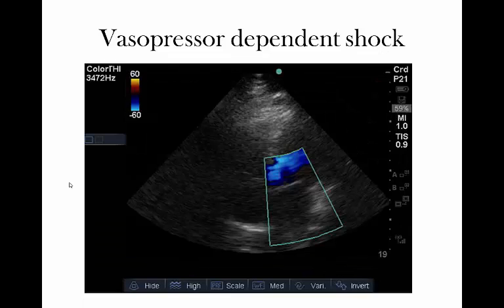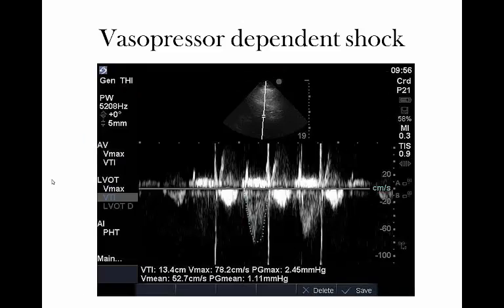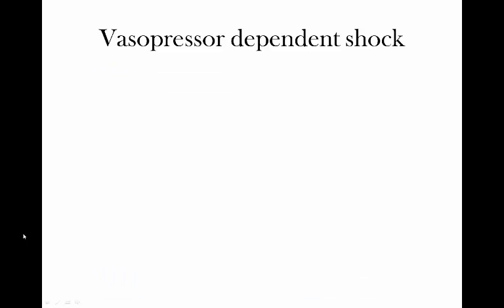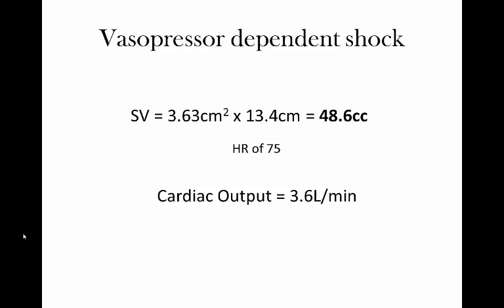We find a somewhat dubious apical 5-chamber, but to be sure we're going to get a good Doppler signal, we throw some color Doppler on. Because we have a reliable blue jet, I'm satisfied that the Doppler information is preserved, and we can pulse that area to get a decent envelope capturing the height of our cylinder — 13.4 centimeters. Running the math, our stroke volume is nearly 49 cc at a relatively low heart rate, giving a cardiac output of 3.6 liters per minute. A pretty lousy cardiac output despite preserved ventricular function.